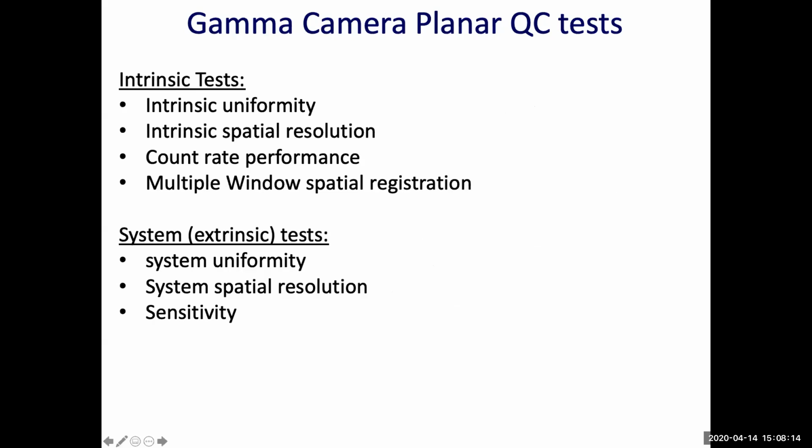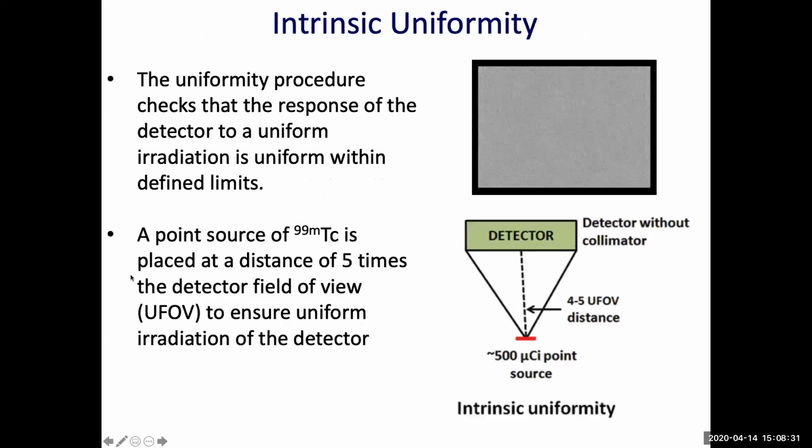So these are the planar tests performed routinely and annually. Most of them are covered in this lecture and the previous lectures. In the next few slides, I'm going to discuss briefly the uniformity and resolution test. We discussed the sensitivity, we discussed the spatial resolution. I will go just through the uniformity.